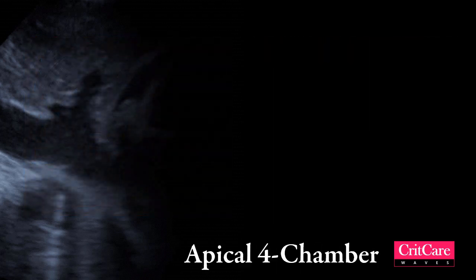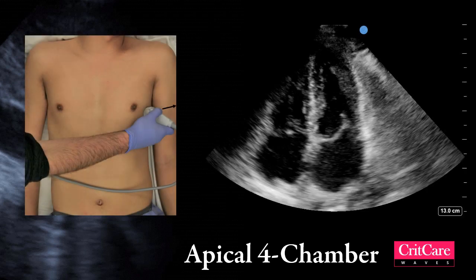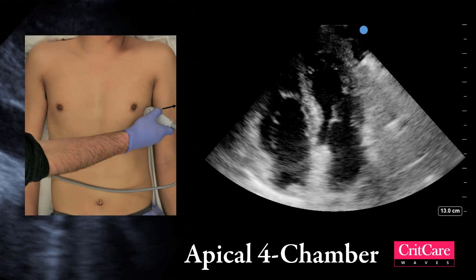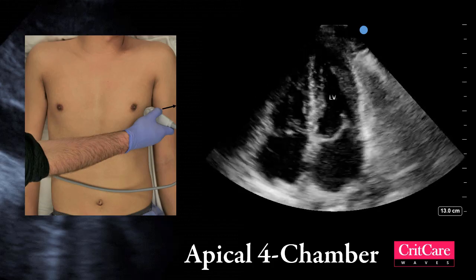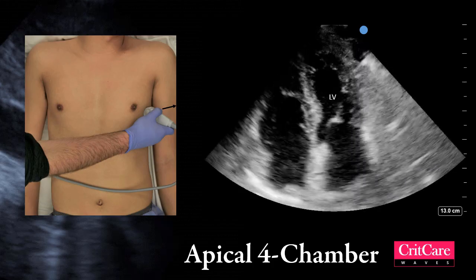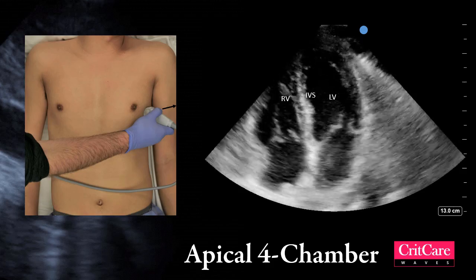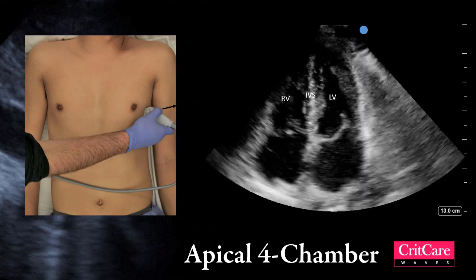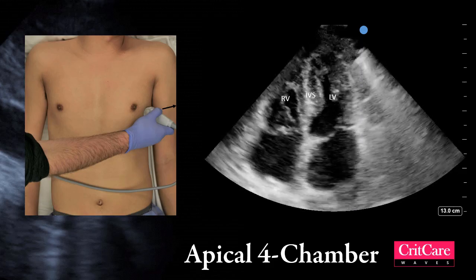Let's start with the apical 4-chamber view. Since our marker is pointing towards the left, the left-sided structures are on the same side as the marker. The thick-walled left ventricle is seen with the right ventricle adjacent to it and the interventricular septum in between.